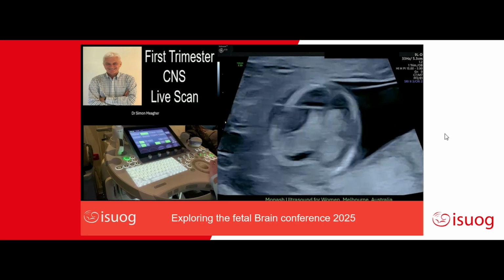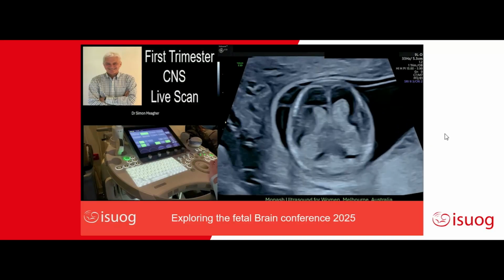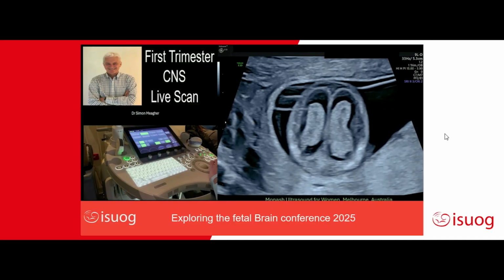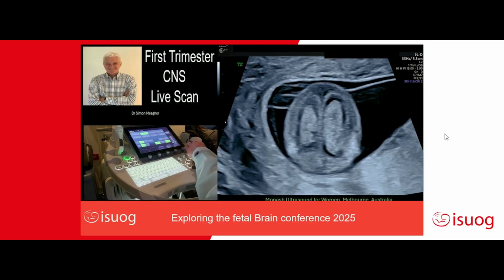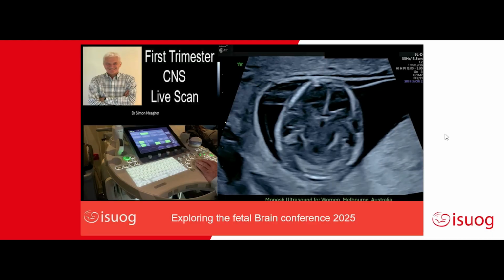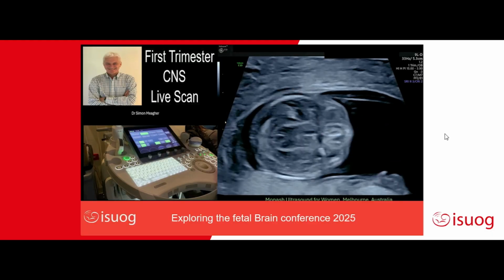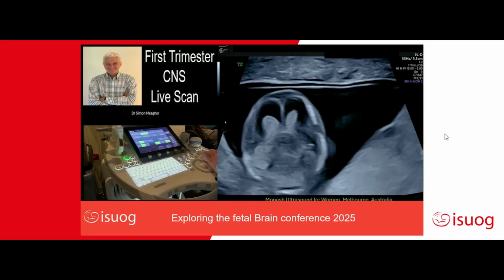The advantage of this section is that it shows you the lateral ventricles being symmetrical on each side more clearly, I think, than in a transverse position. It shows the choroids more clearly, but for the midbrain, the posterior brain, I think you're better off having it in a transverse position. So that's, in summary, the completion of the brain.